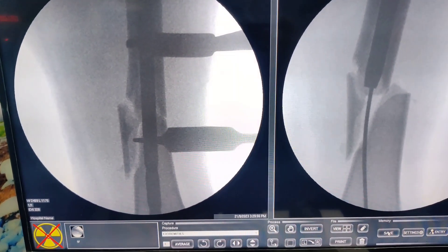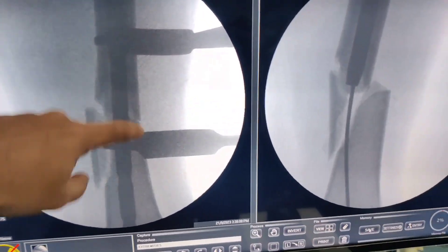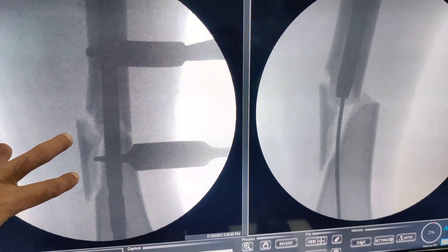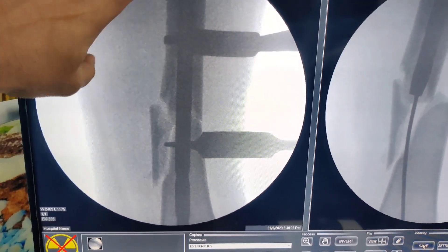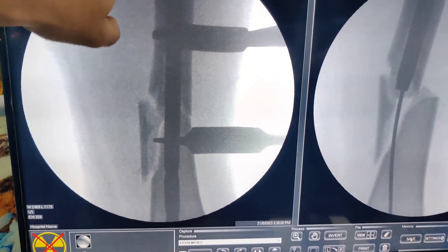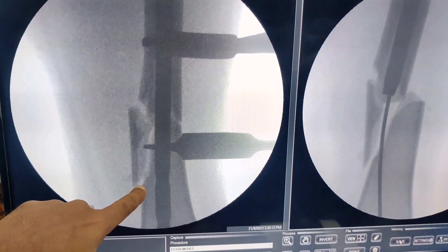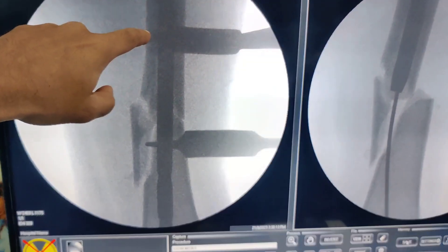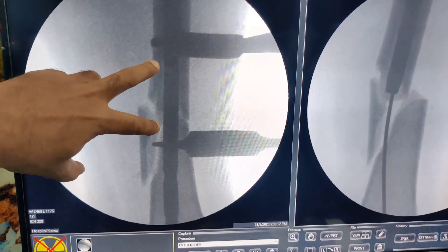The nail has gone so easily and the fracture is anatomically reduced. This butterfly fragment I am just going to ignore because it is going to heal beautifully without any problem. Previously when we were trying closed, every time the nail was hitting the lateral cortex and they were struggling for around 20 minutes. Once we made these two stab holes, life became so much easier.